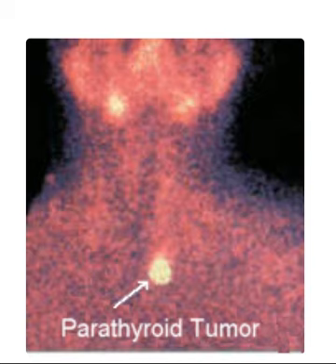Is a Sestamibi scan the only test required for a doctor to diagnose HPT? A Sestamibi scan is valuable, as it helps a doctor identify one or more overactive parathyroid glands that may contribute to HPT symptoms. Yet a Sestamibi scan has a lot of nuances that make it not be the best test to identify the abnormal gland. At the center, we rarely use the Sestamibi scan because we find the other scans to be more informative.